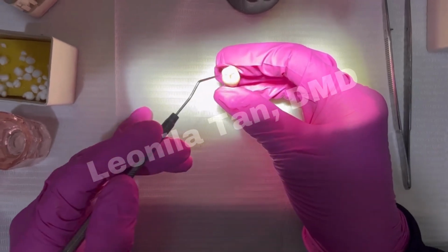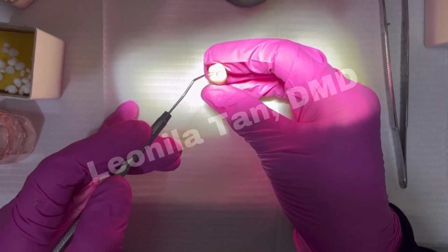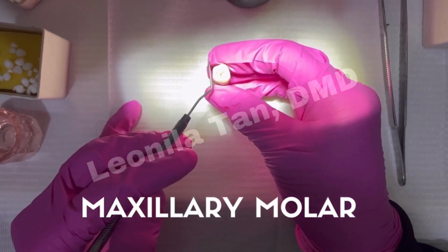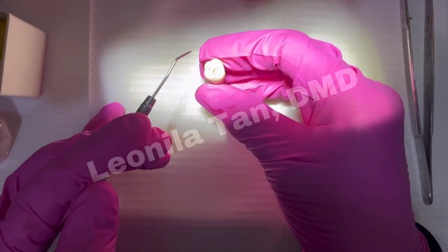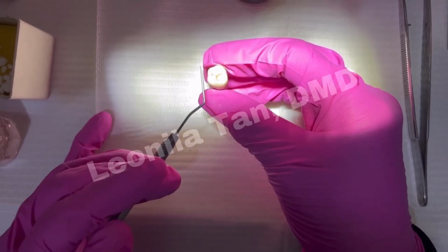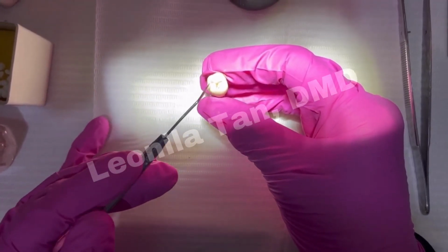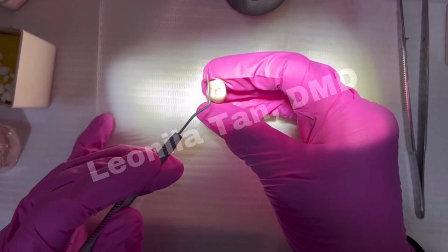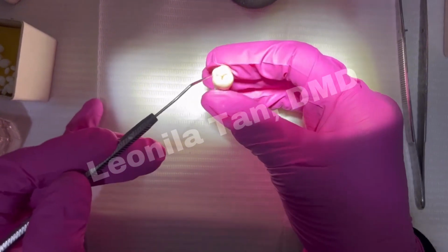This demonstration is going to be on the access preparation for maxillary molars. To understand the access preparation form of the maxillary molar, we need to understand the anatomy first. Your outline form or the access preparation form always is on the mesial side of the tooth.